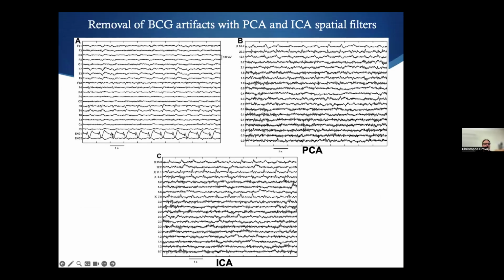So these are some examples. This is not using optimal basis sets, but these are slides from Christian Bénard. So of course, there will be ICA there. You see the EEG here with all those ballistocardiograms that you see very nicely here. And this is a correction from PCA, which is not bad. And this is a correction from ICA.